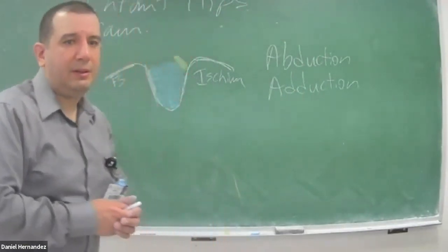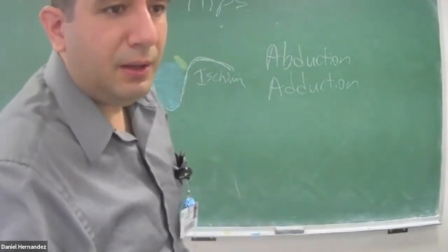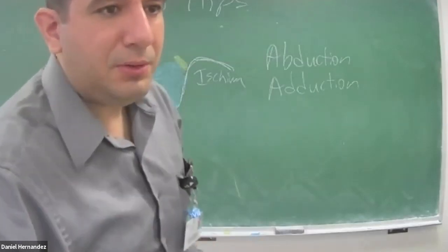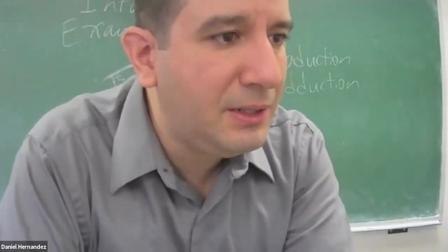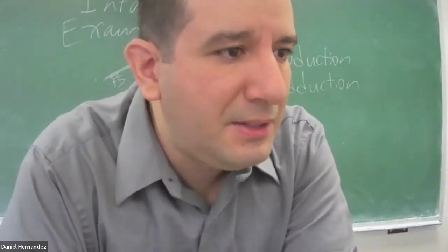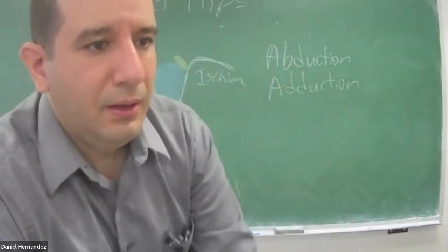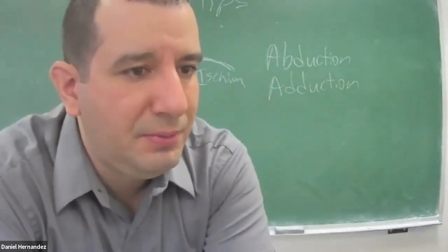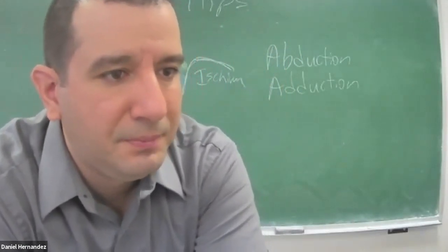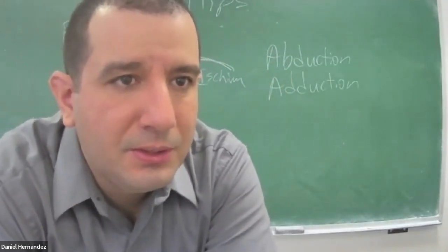Initial treatment of uncomplicated DDH is closed reduction. This is accomplished by placing 2 diapers on the neonate or by using a spica cast, brace, or a Pavlik harness. The hip should be positioned in flexion with abduction and external rotation. All right, so let me show you guys what this harness looks like.